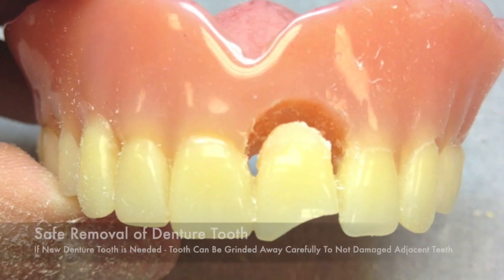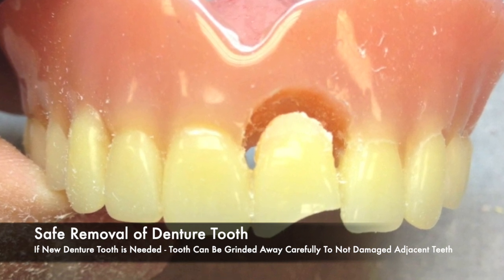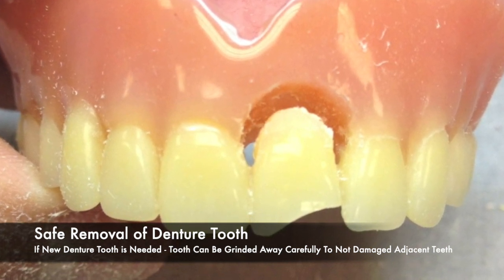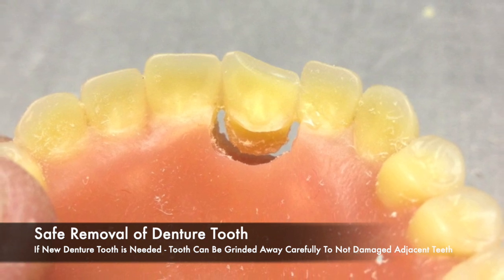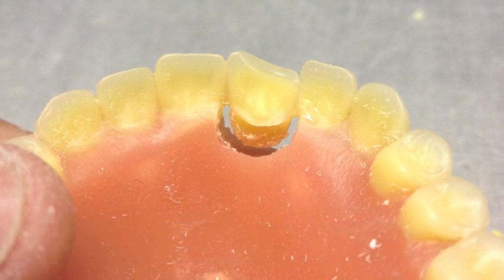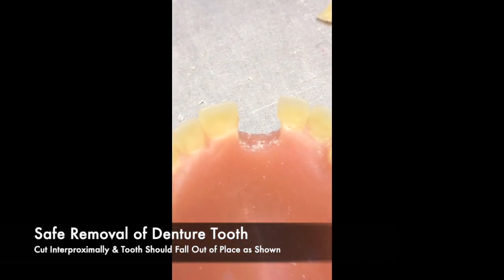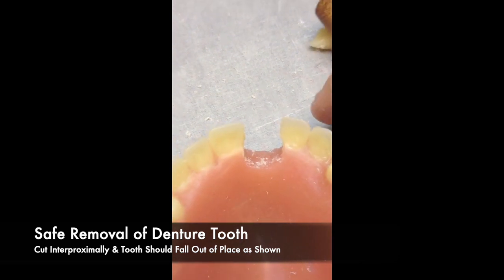If a tooth is chipped or broken, it is more than likely that you will be replacing the tooth entirely. In that case, you can grind away the tooth completely. Be sure to grind carefully so as not to damage adjacent teeth. If you are going to remove the tooth safely, cut in proximally and the tooth should fall out of place as shown.